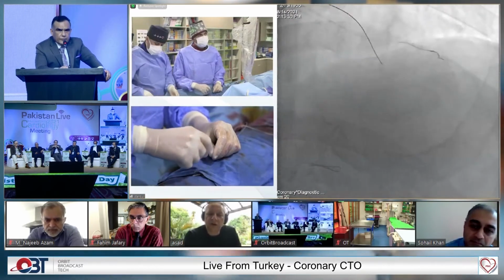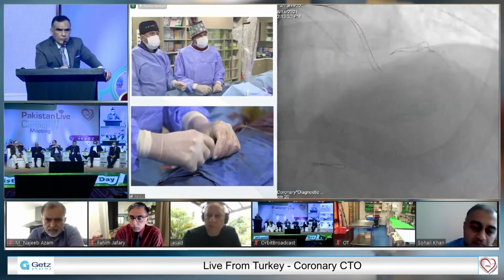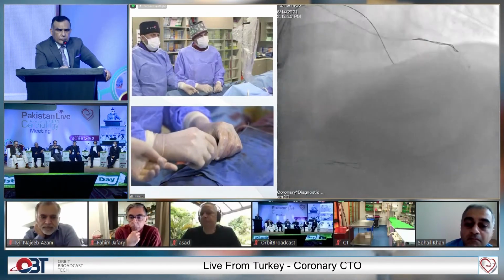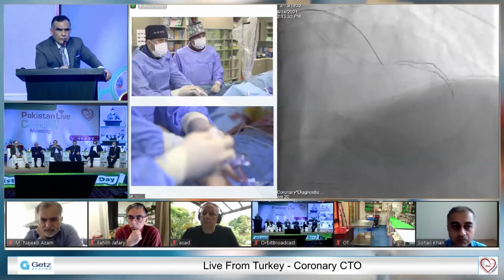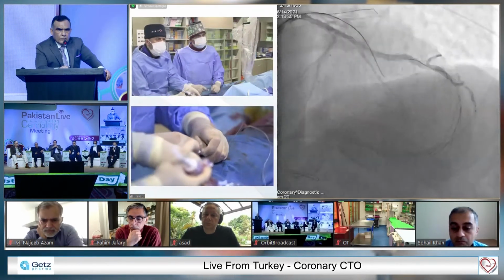So, Omar, going through epicardial, do you think a softer Suoh wire with a Caravel would be a better option for wire and microcatheter? No, Fine Cross is nice. Even here, it's tiny, so it aids the microcatheter. I don't think any problem will happen with the Corsair here.